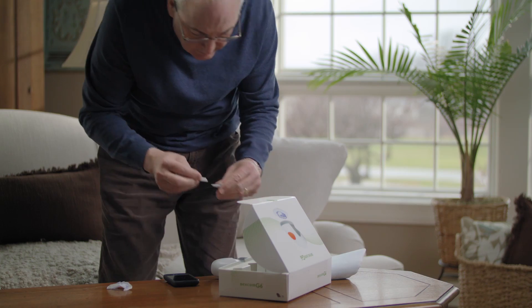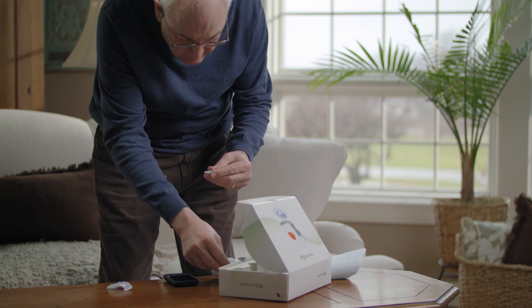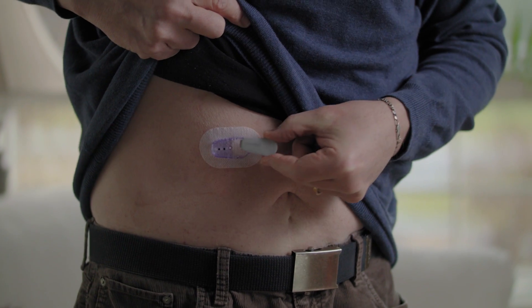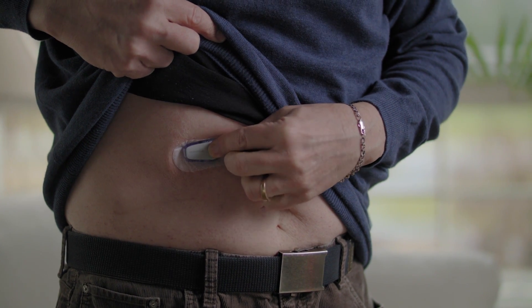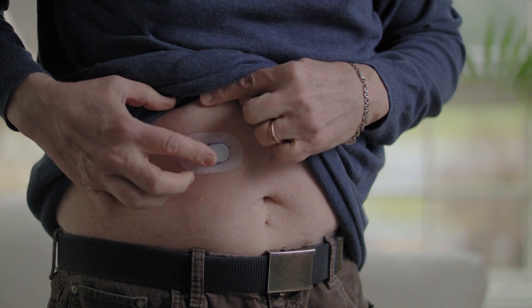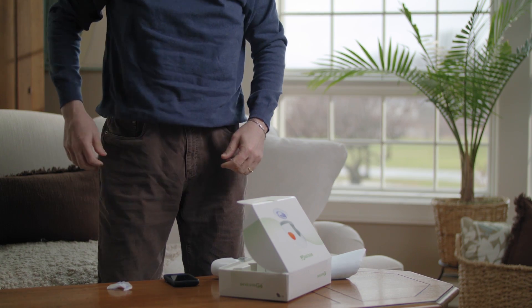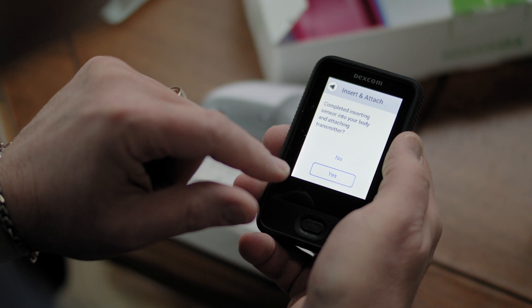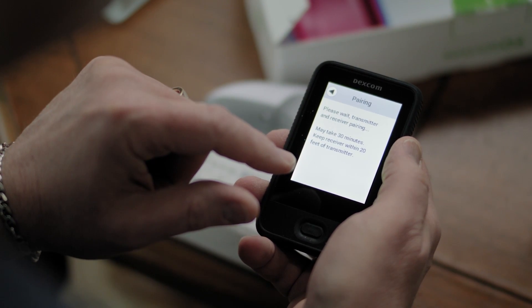Now it's time to attach your transmitter. Clean your transmitter with an alcohol wipe and let it dry. Insert the transmitter tab into the slot. Snap the transmitter firmly into place. Rub around the patch three times. Now, back on your receiver, tap yes on the screen saying you have completed inserting your sensor and attaching your transmitter.